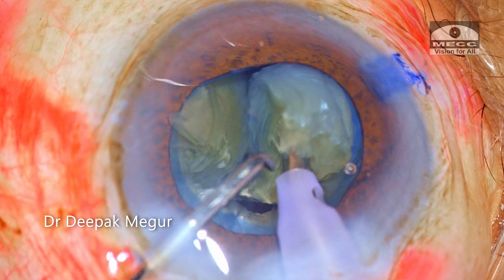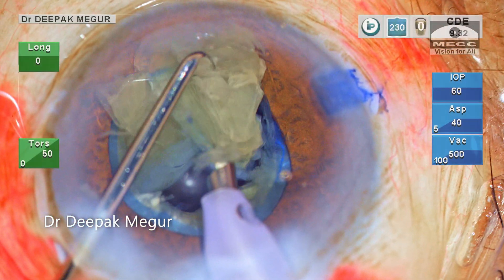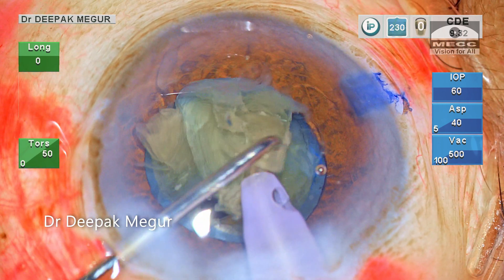I am now switching to fragment removal mode. Each of these fragments are emulsified at the pupillary plane.